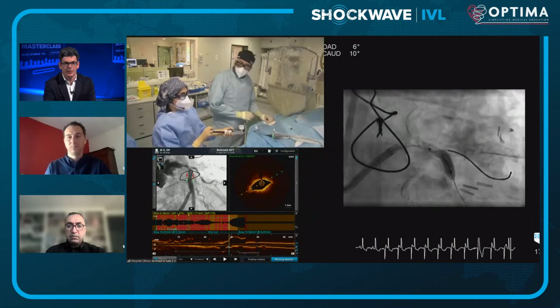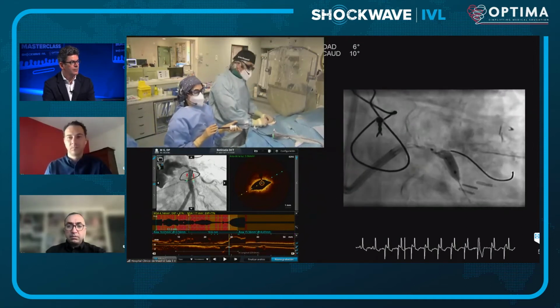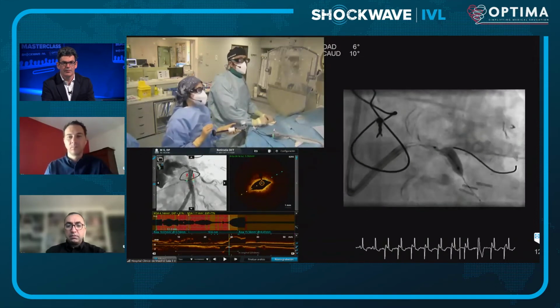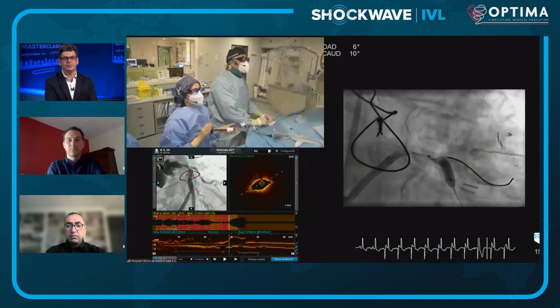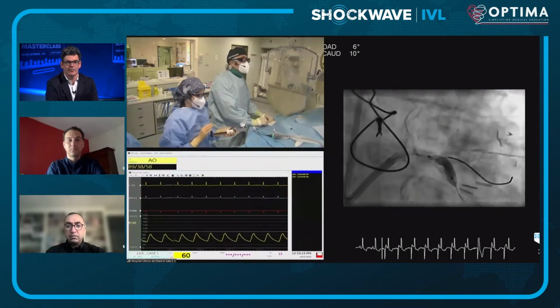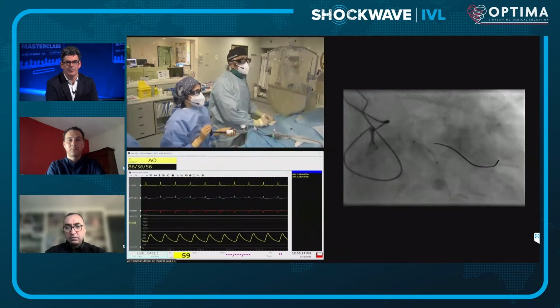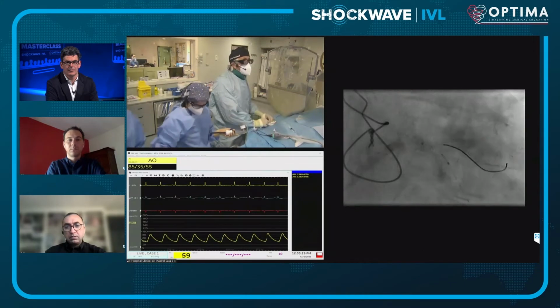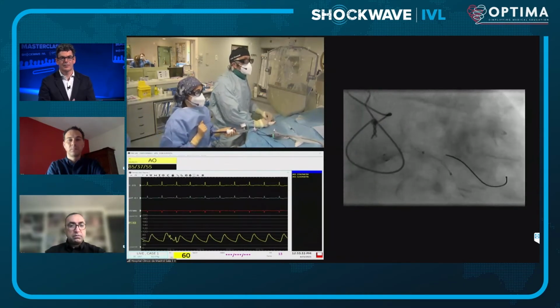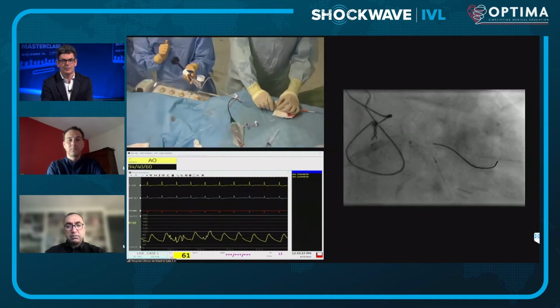Okay. Yeah, actually, in this region around the side branches where we had all this concentric calcium. Yeah. Perhaps we could show the EKG for a second to the colleagues in the lower part. It will be nice so they can see that there are no ischemic changes. It will also be interesting because sometimes during the delivery of energy, you can see some captures. So you will be able to see that. In general, there is no problem with that.